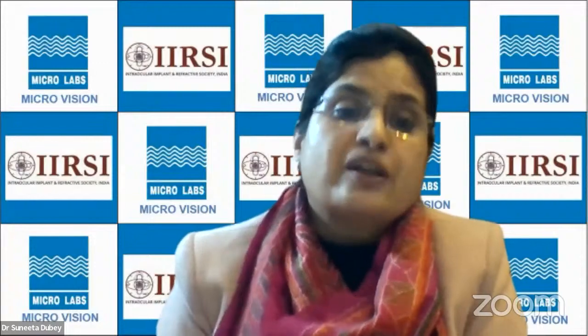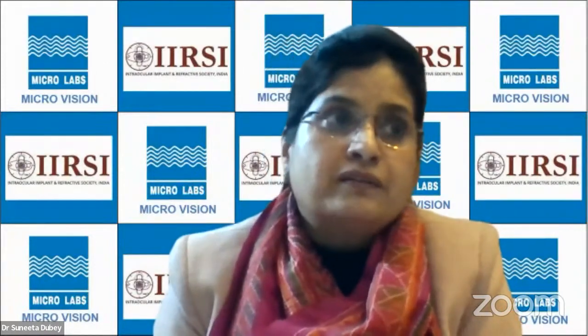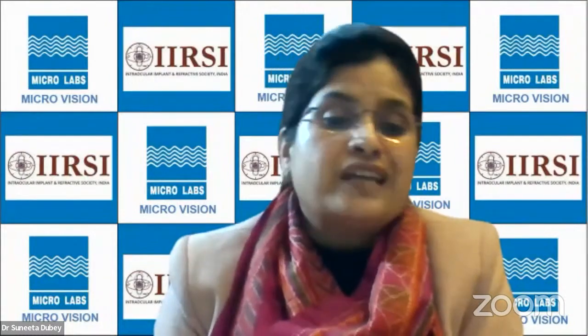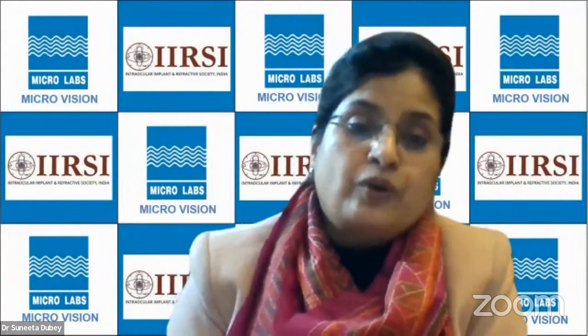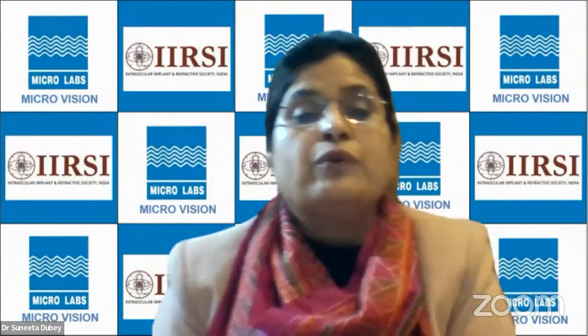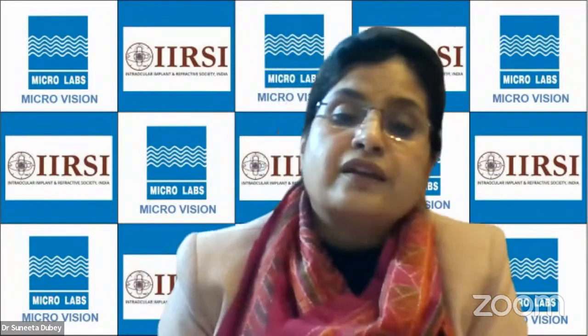I think subconjunctival can also be given if the patient is cooperative. And I think caution should be taken not to cause subconjunctival hemorrhage, especially because we are going to give the subconjunctival in the quadrant where we are going to operate. So I think that is very important.